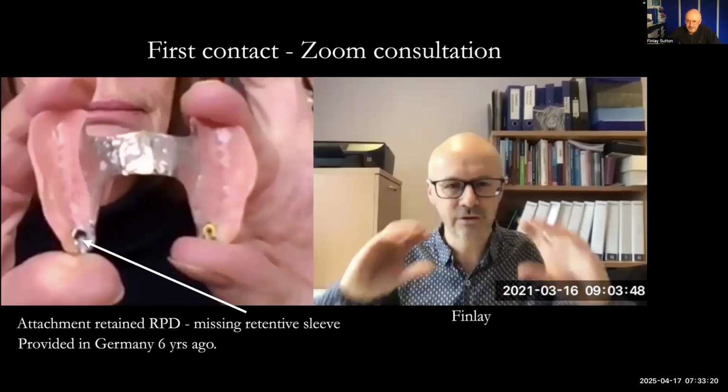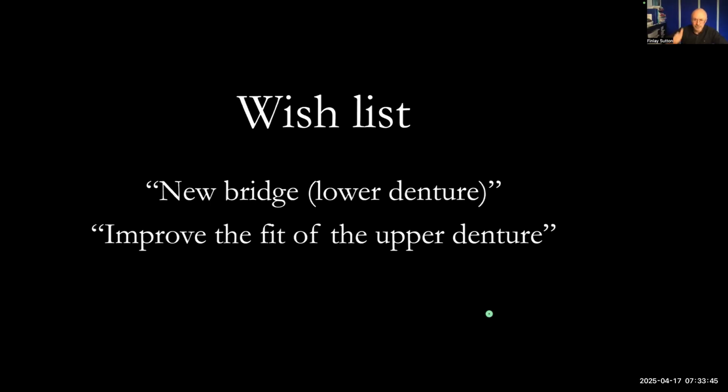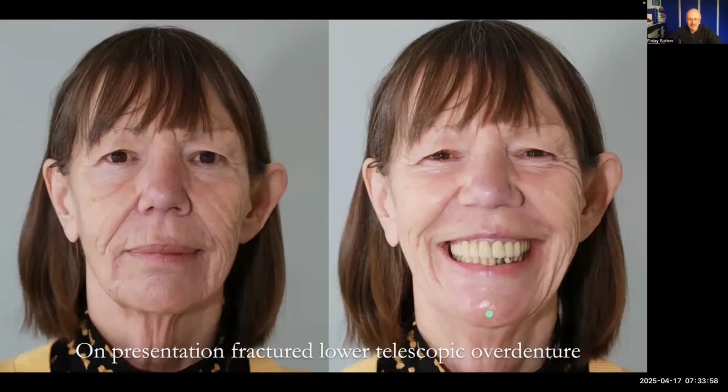Let's go for it. So, these were Jackie's concerns. She's got this fractured lower, she called it a bridge, that sat on those telescopic copings. She wanted that replacing, and she also had that loose upper partial denture because there was a missing attachment on that too. Her wish list was a new lower bridge and improved fit of the upper denture. Interestingly, she had absolutely no concerns at all about the aesthetics. Apart from where it's just fractured away there, the rest of the whole thing, she was happy with.